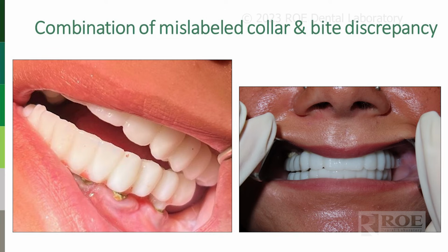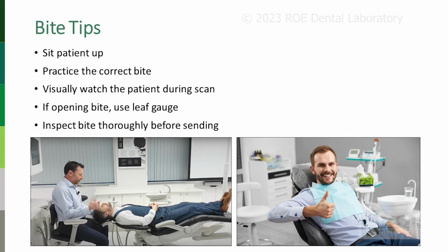And then just again, be careful about collar heights because although they really should only interrupt the registration of the tissue scan, if we have different healing collars, it can throw off what we think about this case, and it can really throw off a bite. It shouldn't, but it can, and it has before. So be very careful with the healing collars.